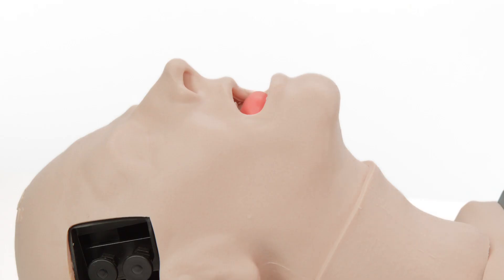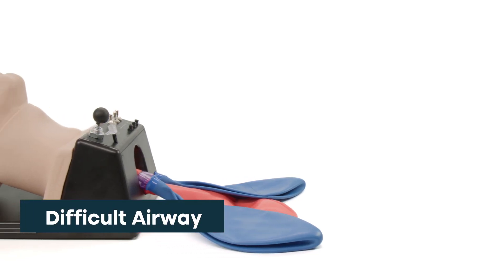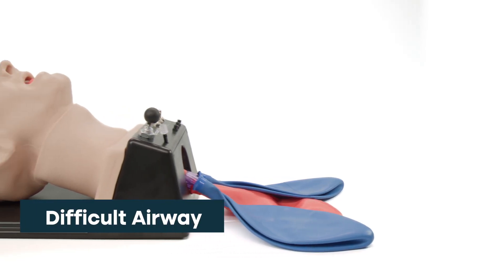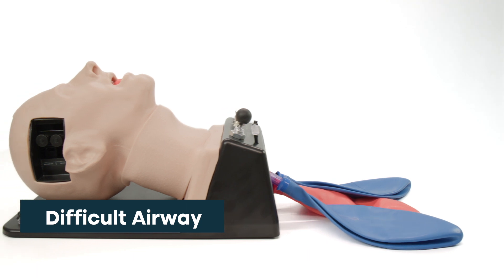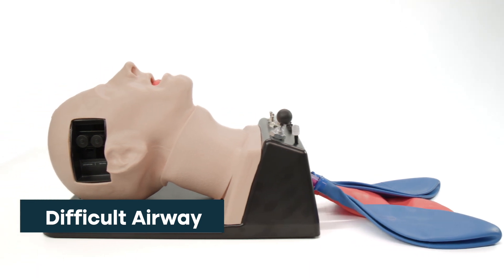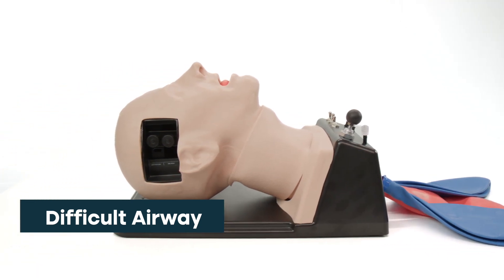Model features include Difficult Airway. The internal airway has an enlarged tongue, swollen posterior cartilages, and an elongated epiglottis.